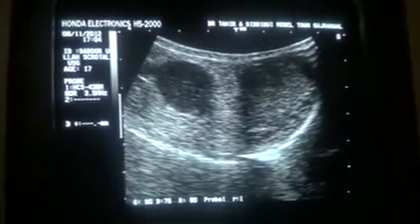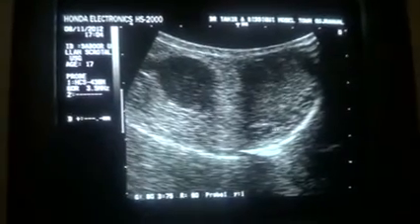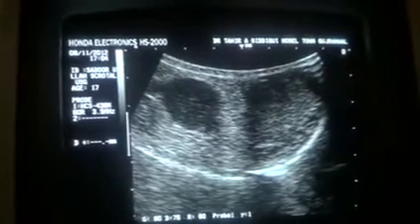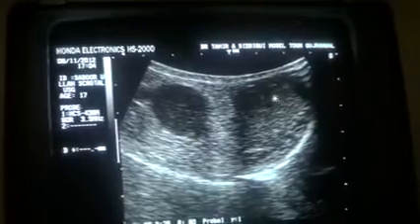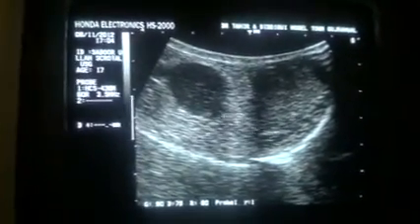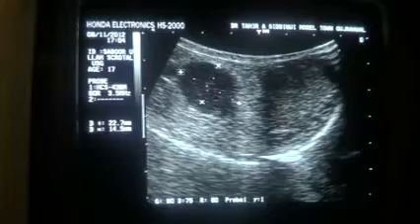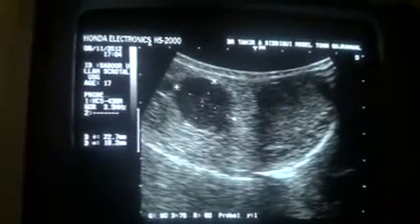which are suggestive of possible varicoceles on the left side, whereas on the right side we do not see the testicular tissue. You can see that the testes should have appeared as we are seeing in the left one. We only see a hypoechoic area measuring 2.27 by 1.82 centimeters.